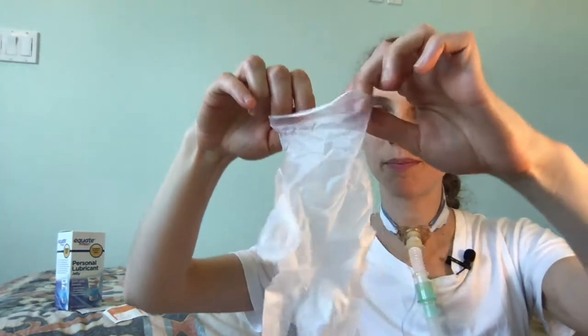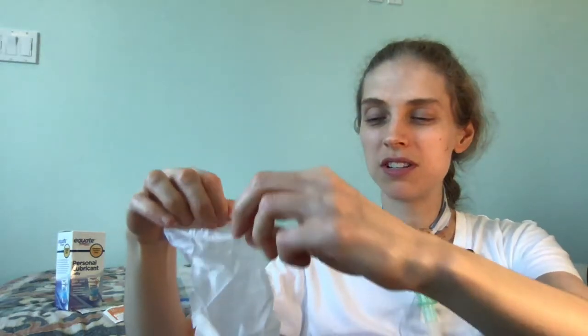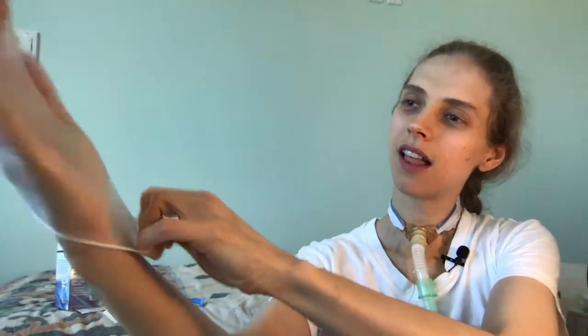Once you have your hands clean, you're going to want to get your gloves. You're going to only touch your gloves by the cuff up here. Please do not touch the bottom of this, because you'll get anything on your hands onto the gloves. So make sure you touch the cuff up here and carefully put on your glove. Then do the same thing with your other glove. Now you can touch anything you want with this other glove, but you're going to try to keep everything up by the cuff.